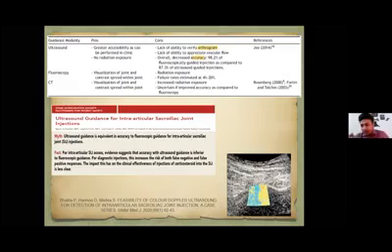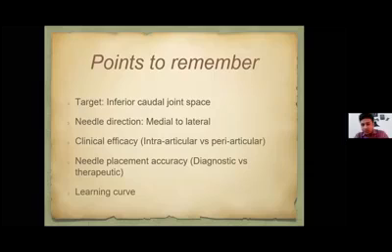They start the color Doppler on the ultrasound, and while giving the drug, if there is flow, there will be reverberations in the color Doppler, and you will see that they are not moving outside, but are inside the joint. Then you are quite sure that you are intra-articular in ultrasound.